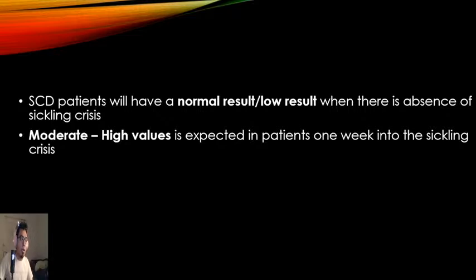Because we're doing automated methodologies, we would just collect a small amount of blood from the kid, who is already a toddler.